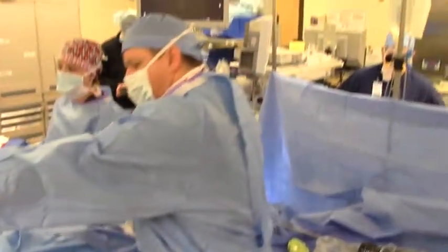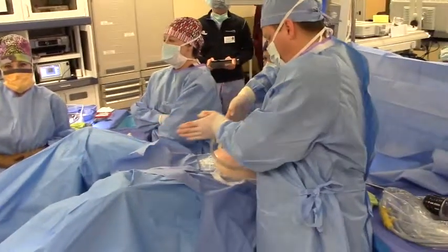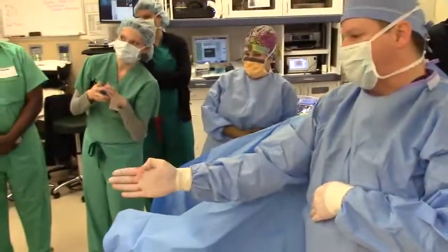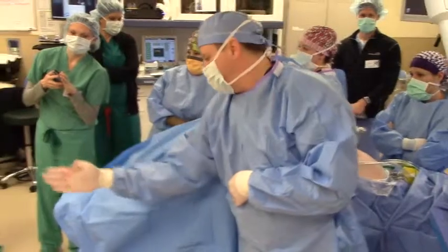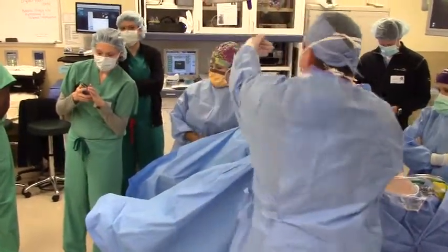So she's going to sight in. As she's coming in, she'll come right across the top of the knee and just kind of bring that around the knee, and then come straight to this point right here. You're going to be at probably about a 25 to 30 degree angle off — that's right here where you want the tower to sit. And everything will stand out this way.